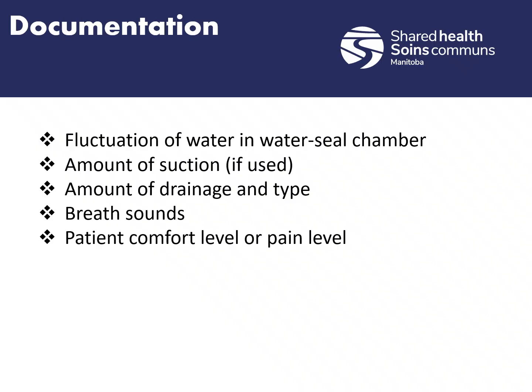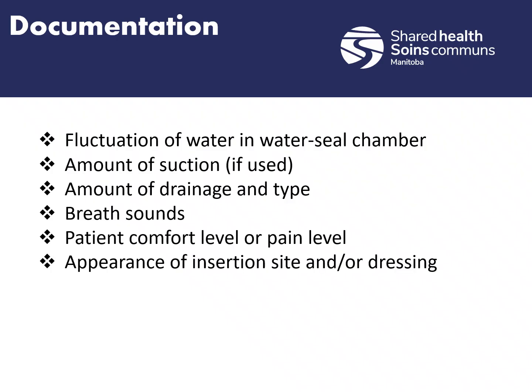Patient's pain level or comfort level. So with that, put the patient in comfort. If they're complaining that it's uncomfortable the entire trip, we can give them pain control. But if that's not really working for them, that's something really to report, because it could be that the tube's moving around, it's dislodged, it's poking them in the lung as their lung reinflates. We don't know. So if they keep having constant ongoing pain, it could be signs of infection as well. So that's something that needs to be investigated. So we want to make sure we document that and report it.